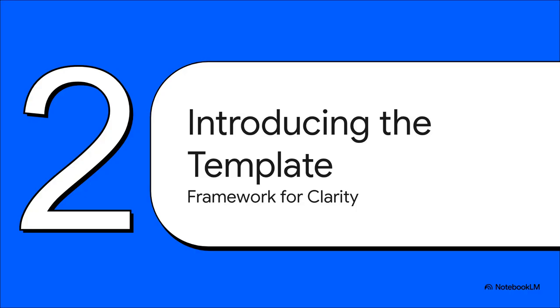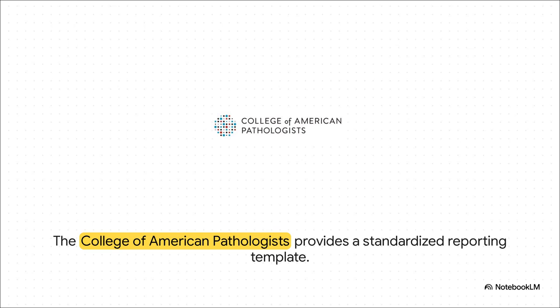Which brings us to the solution, the CAP template. To get rid of that confusion, CAP rolled out this standardized electronic template. And I want to be clear, this isn't just some friendly suggestion. It's a really solid framework built to bring some much-needed clarity and consistency to all of our IHC reporting. And here it is in all its glory. We're looking at version 1.2.0.0. This thing is purpose-built for reporting quantitative IHC biomarkers in carcinoma.